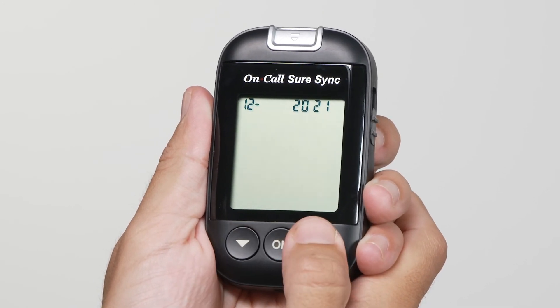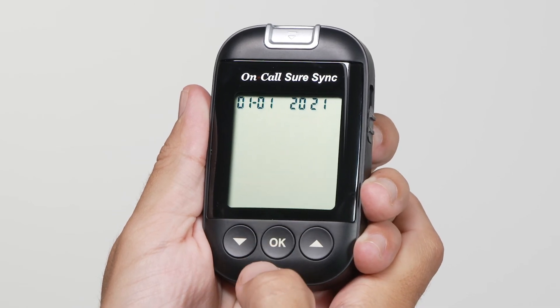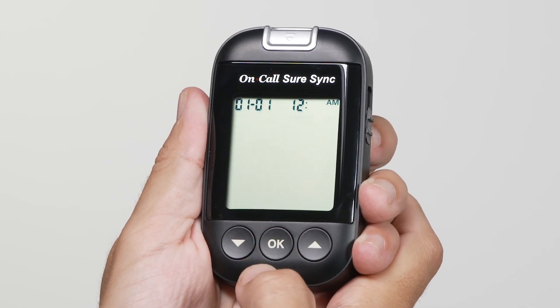Press the down or up button to increase or decrease the month. Then press the OK button to save your choice and start setting the date. Press the down or up button to increase or decrease the date. Then press the OK button to save your choice and start setting the time.